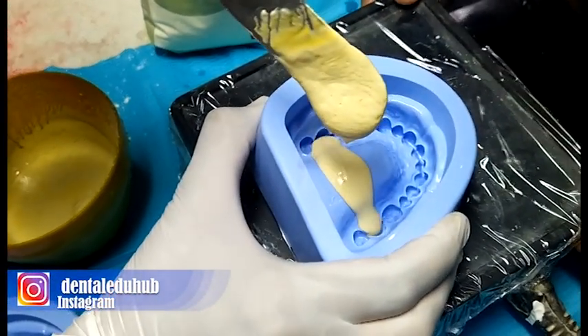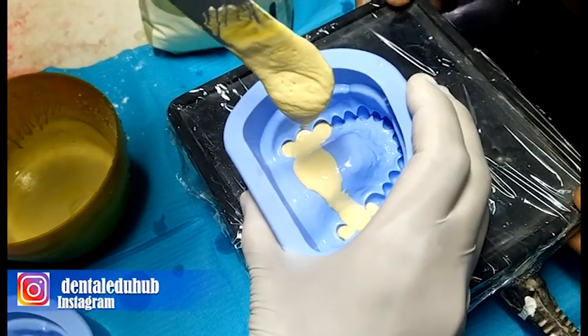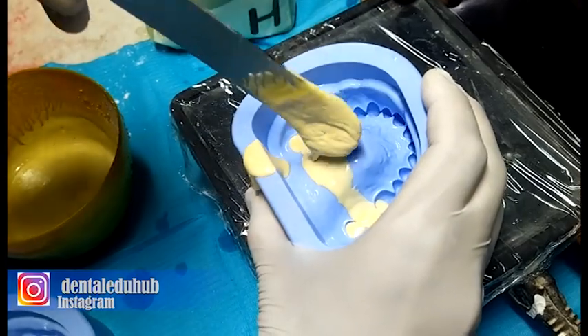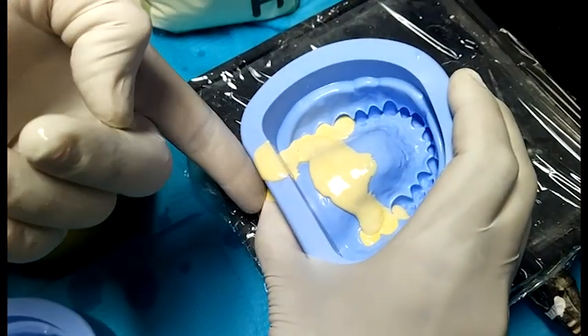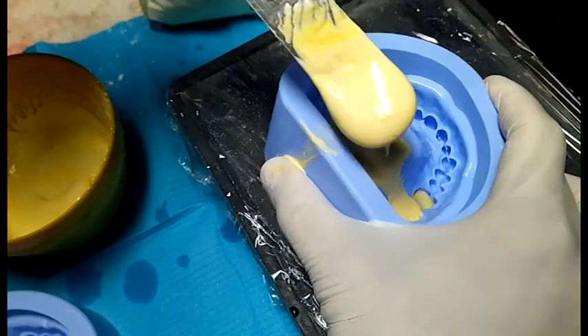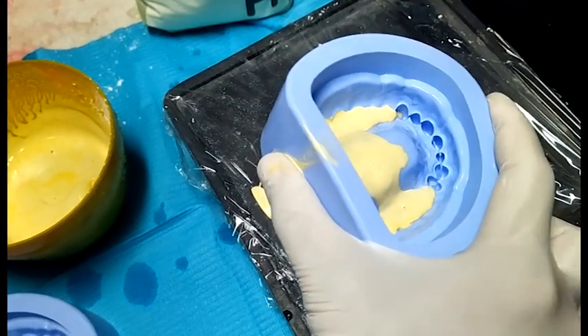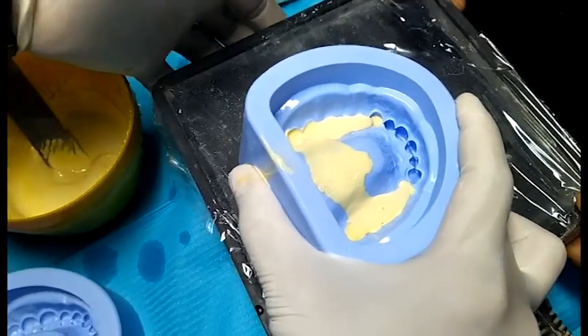A separator such as Vaseline is applied. Now we are pouring the plaster into the maxillary dental mold. The mold is placed on a dental vibrator. We will fill the teeth first with the dental plaster because this part has more chances of porosity.